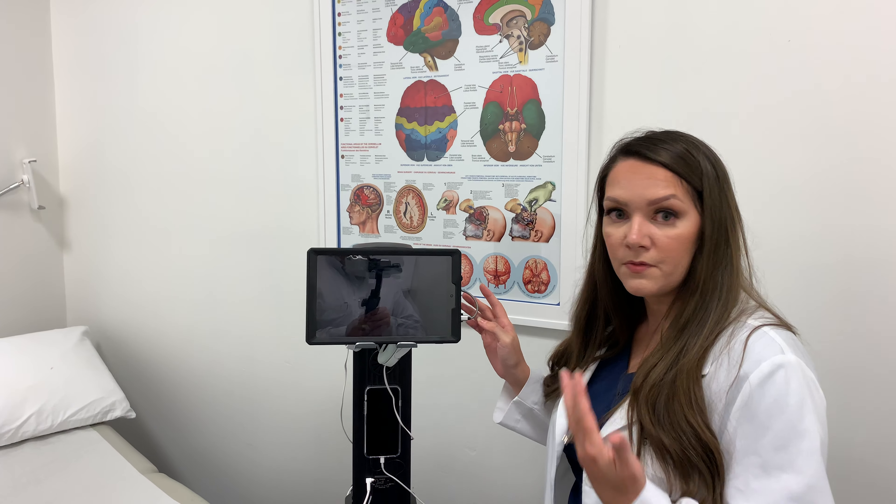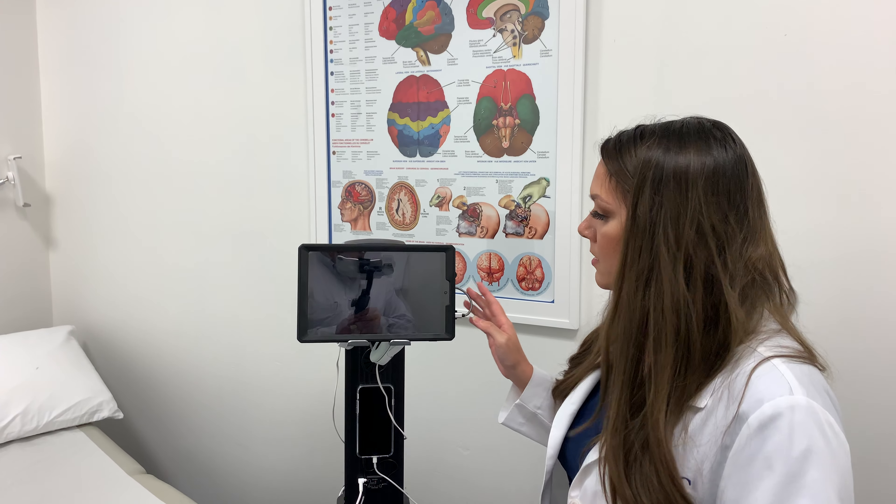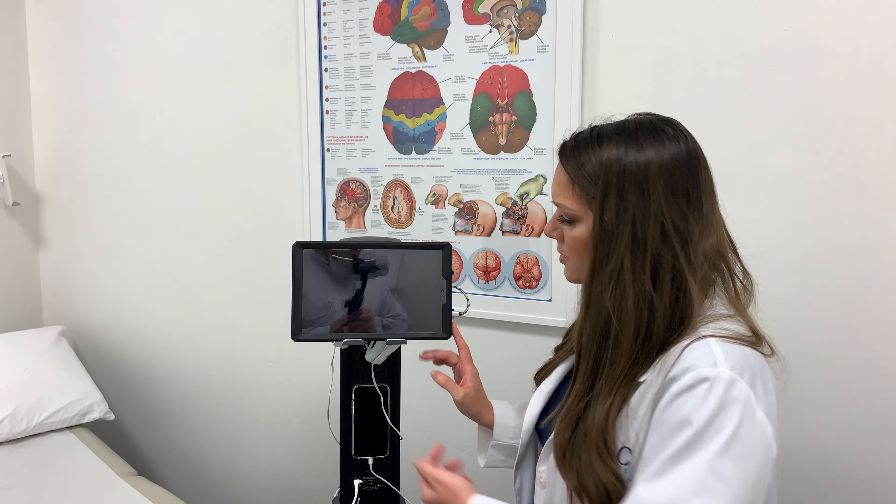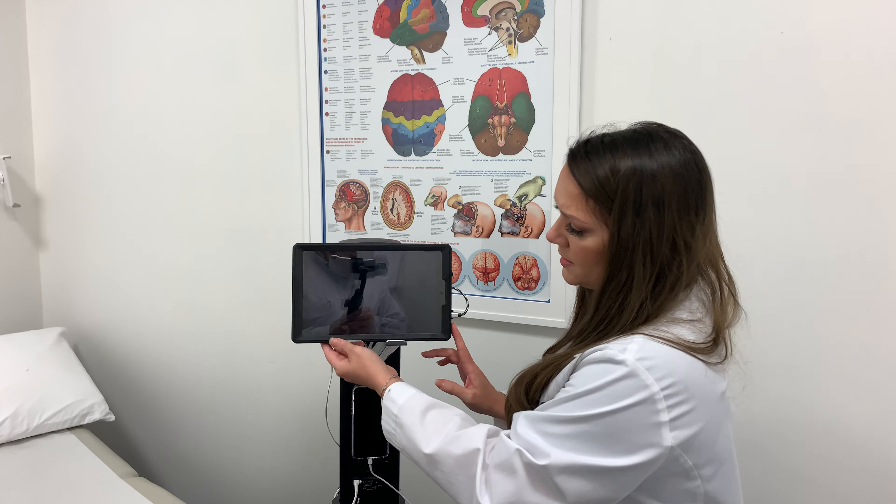Hi, I'm Crystal Jaynes. I'm a nurse practitioner with PHC. I'm here to introduce to you our telehealth workstation.